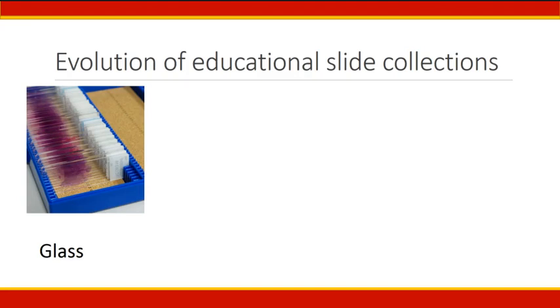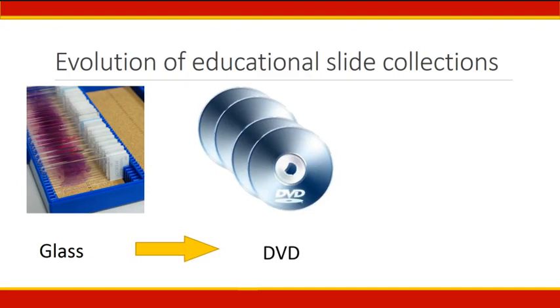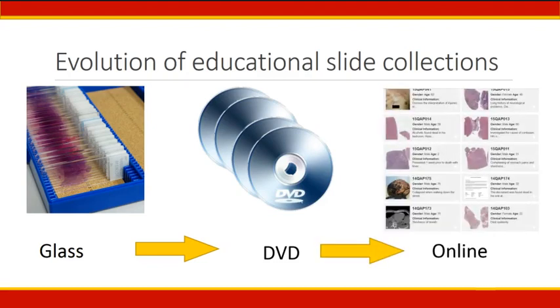DVDs of virtual slides, such as the QAP cases or the IAP Companion Club, allow us to have a permanent non-fading record, but again the discs also languish at the back of my cupboard. When I reflected on why I really use them, it's because when I need to pattern match a particular diagnosis, it's much quicker to look at online images or in a textbook atlas because the cases are indexed and searchable.